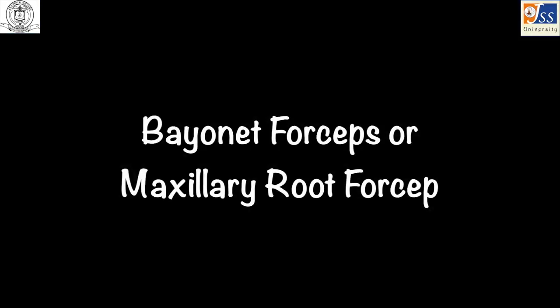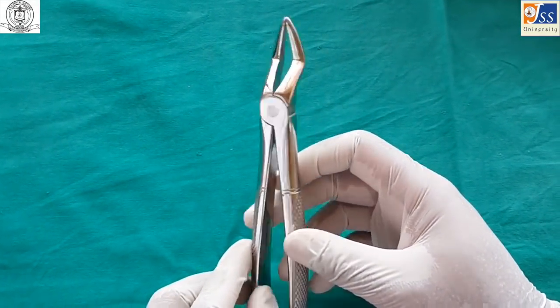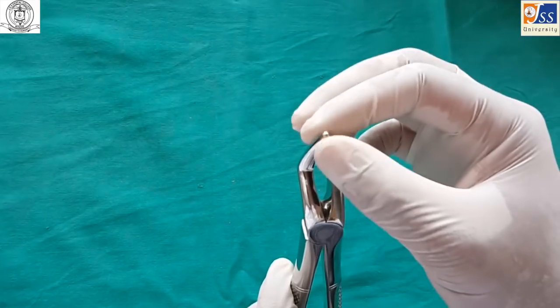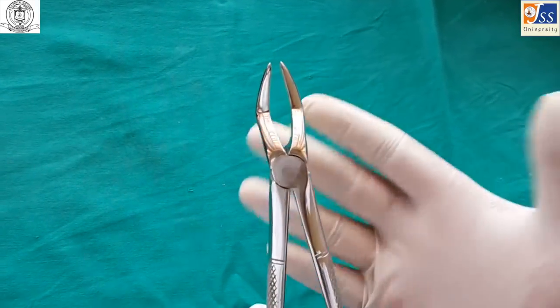The maxillary root forceps, also known as bayonet forceps, is used for extraction of root stumps. The beaks are tapered and the tips mate to get a better grip over root stumps.